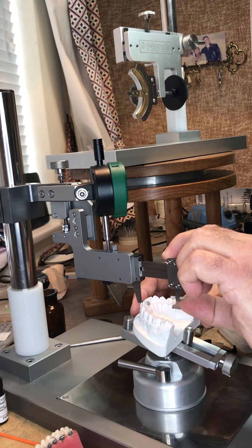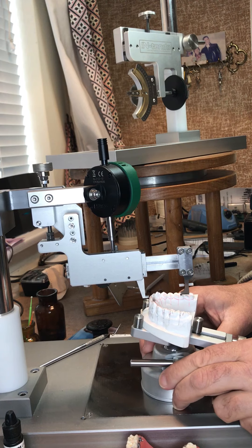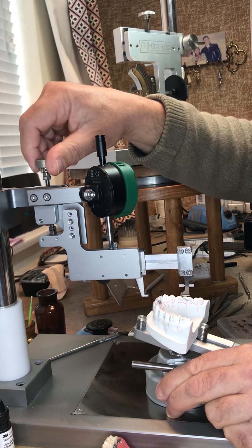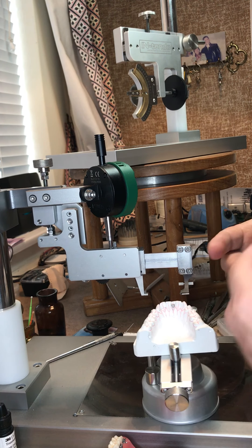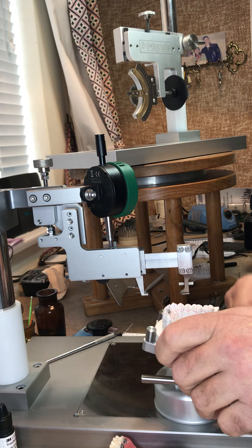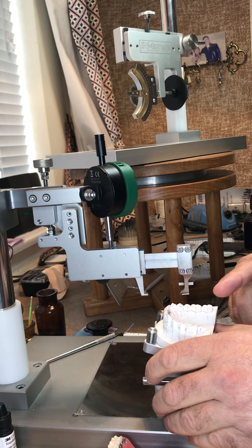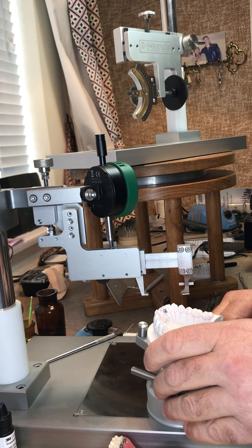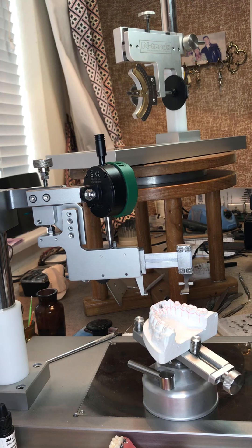I pull out holding this lever to keep the jaws closed so there's no friction, and the bracket is in place. As you can see, it's a very quick, very easy procedure to follow. Once you get proficient at this, you can do your individualized bonding in-house for labial or lingual. With labial it's quicker because you don't need to compensate any thickness — you just find your plane, your height, and bond, measuring from your reference cusps. You can also adjust heights, so if you want your canines half a millimeter lower, very easy, very quick, and not complicated at all.